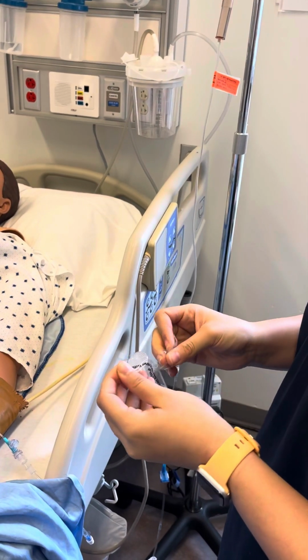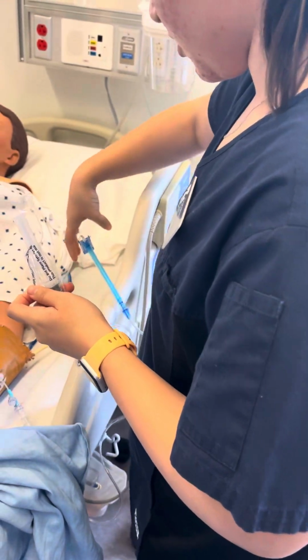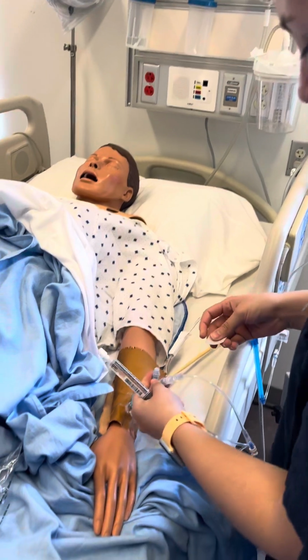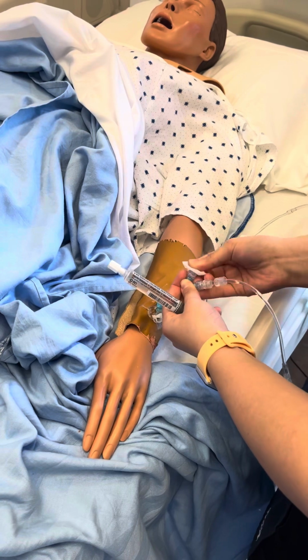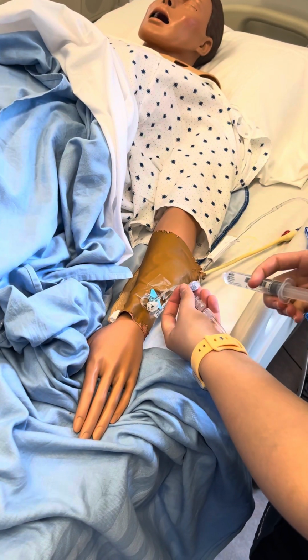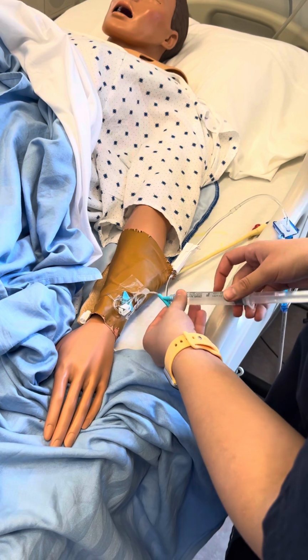Okay, and then I'm gonna flush the IV here. So I'm gonna clamp that really quick and clamp this. This might have a Curos cap on it, but it doesn't right now, so I'm just gonna swap that. Open that. Take this off. Or sorry, that would have been closed, then I would have opened it. And then that's on secure.